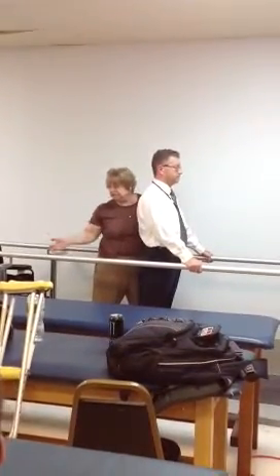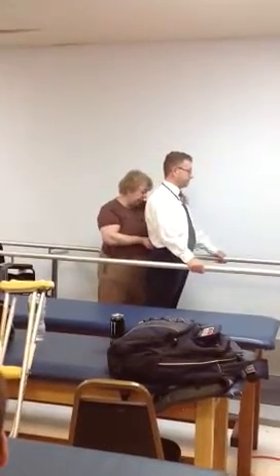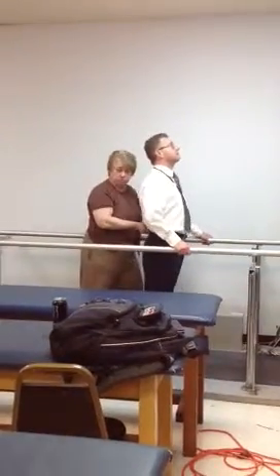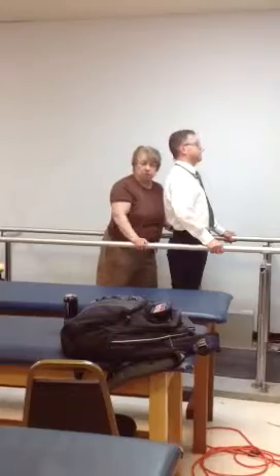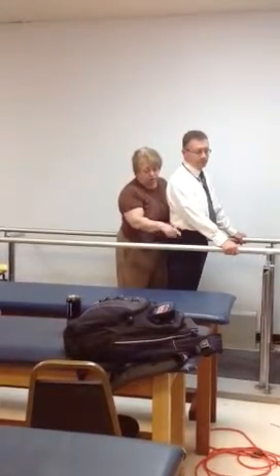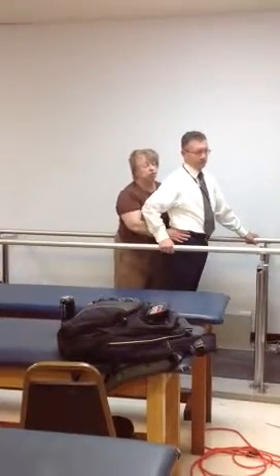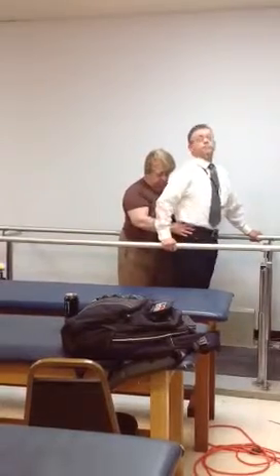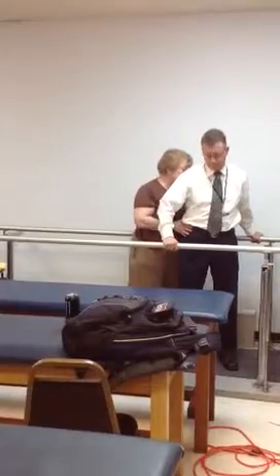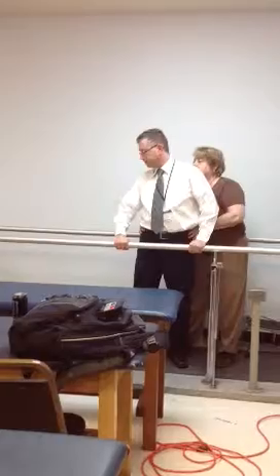Before this, you might have demonstrated what you want them to do, okay? So go drag toward the end. You don't have to worry too much about where your hand placement is at all. Okay, now for the turn, you're gonna put one hand a little bit further back, and one hand further forward. Do a push-up and look to your right. Okay. Push-up, look to your right. Okay, switch your hands. And then I'm gonna sneak around behind him, okay?